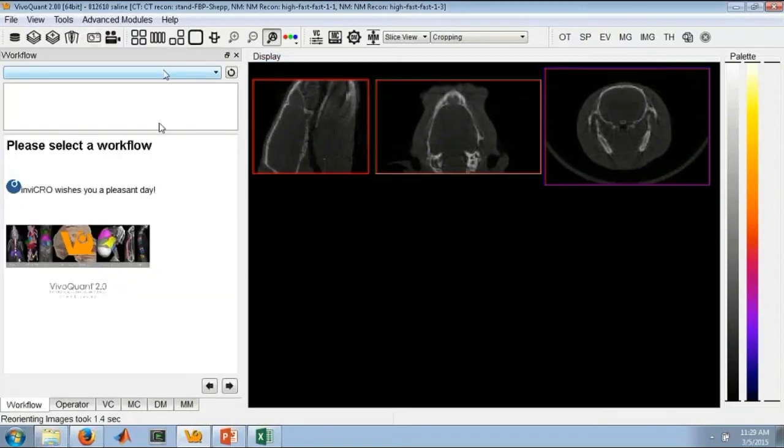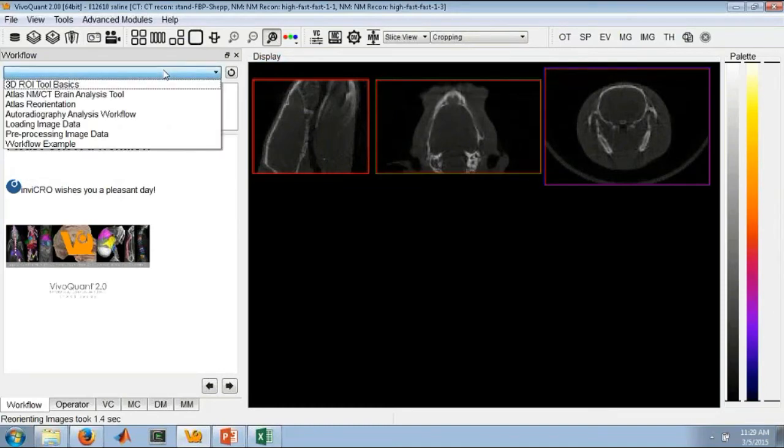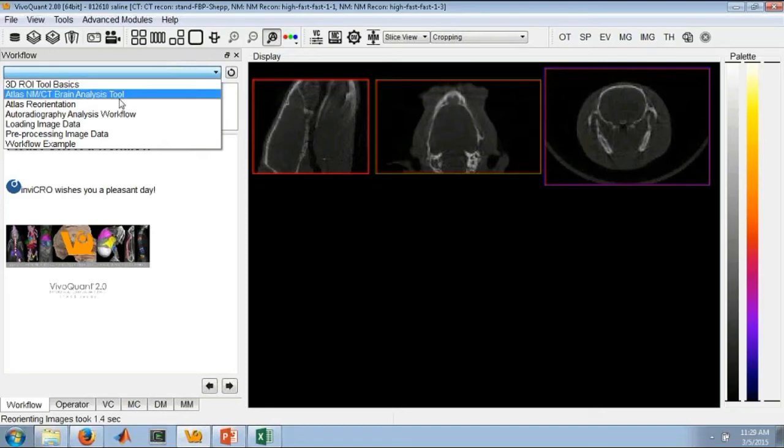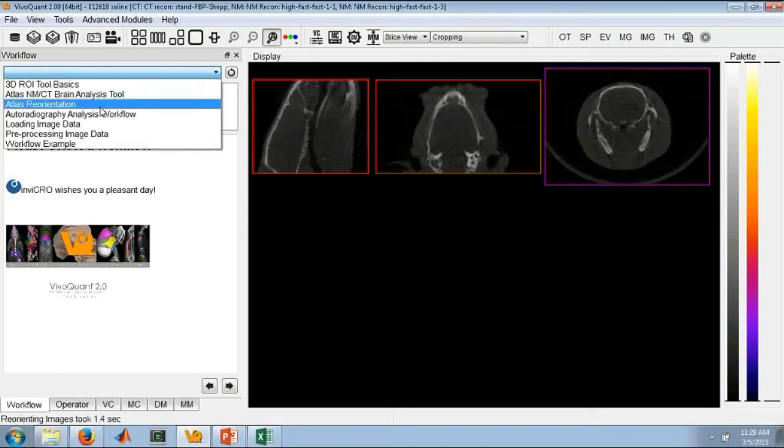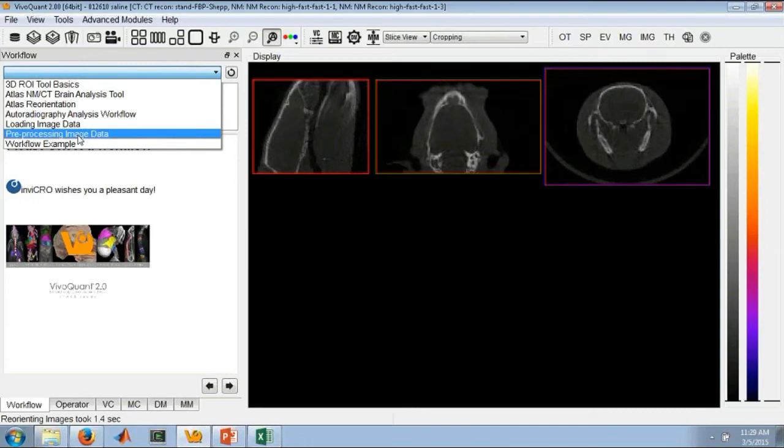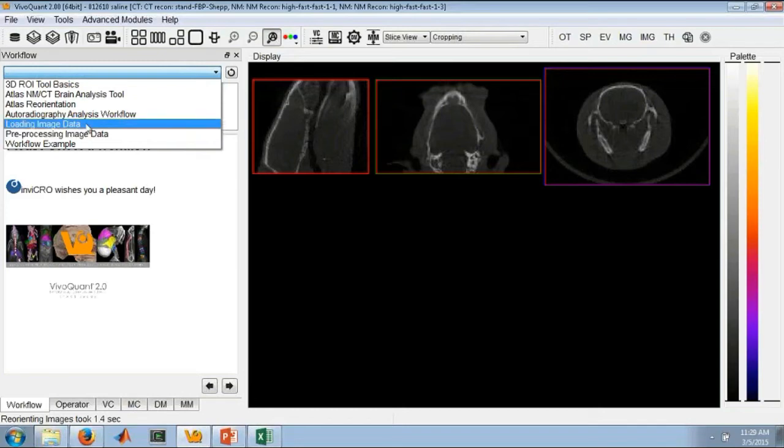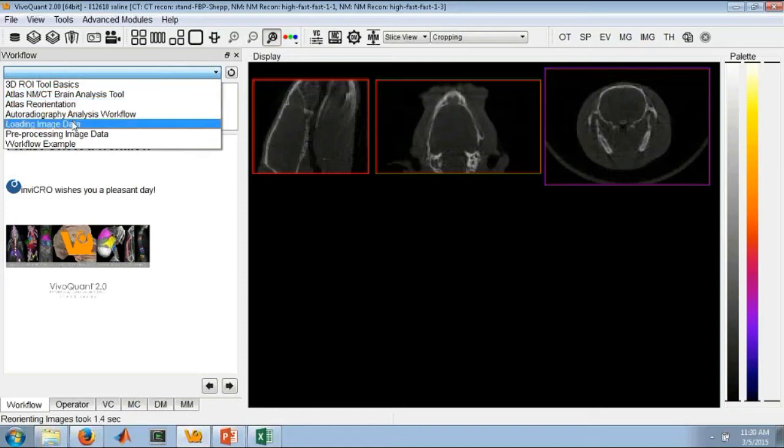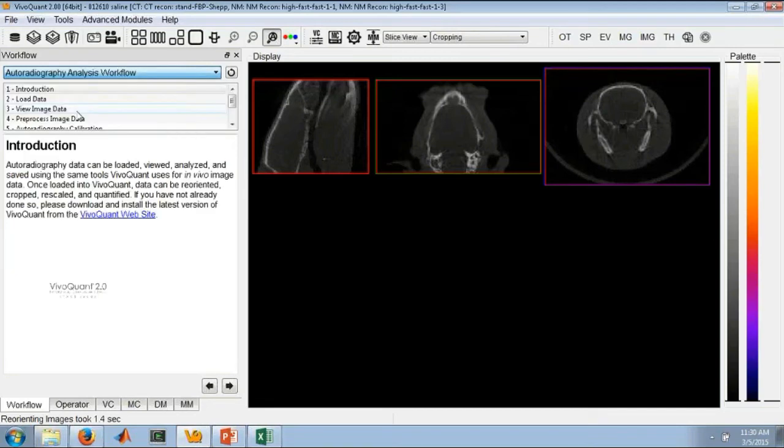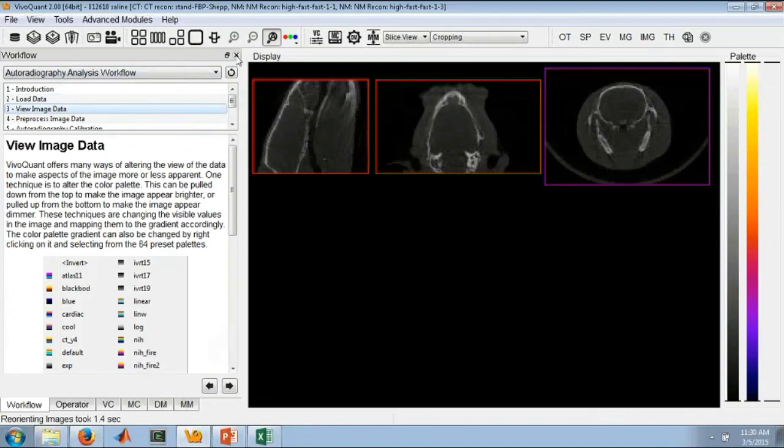Looking at some additional tools that we've moved, the Workflow Assistant preprocessing tool and resampling data are now directly under the Tools menu. For anyone not familiar with the Workflow Assistant, this is a very nice tool that allows users to write their own workflows. You can write step-by-step instructions for your colleagues to always follow the same procedure, whether they're preprocessing data, making QC images, whatever the case may be. These are simple XML files. This is an old tool, but it's important to know that it's still active. We've also added some additional new functionality or new workflows into the default tools here. We've edited the existing ones to update along with new tool locations within the software. We've also added the autoradiography analysis workflow, which I'll go through live later on.